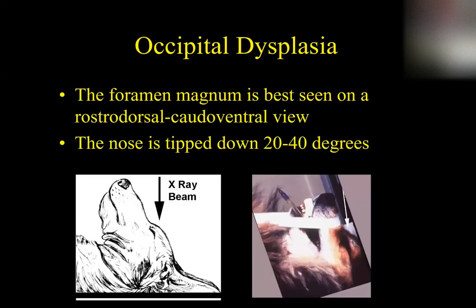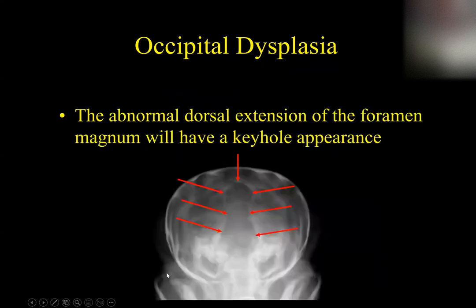So here, this is crappy film, but here are pictures of how you would try to position a dog to see this radiographically. You put their nose right here and you shoot the x-ray, kind of picking off where the frontal sinus is on the top of the brain. And if you get lucky, again, the right side should look just like the left side. You have to make sure their nose is straight. It can't be off to one side, to the left or to the right.